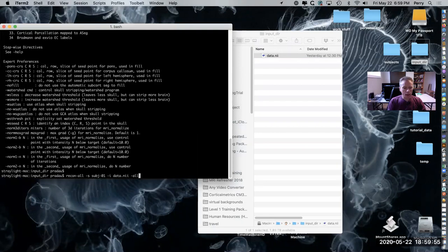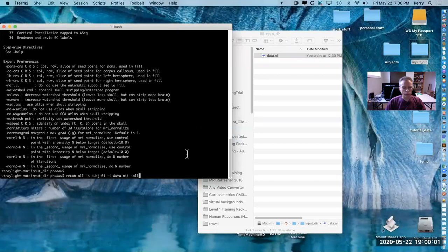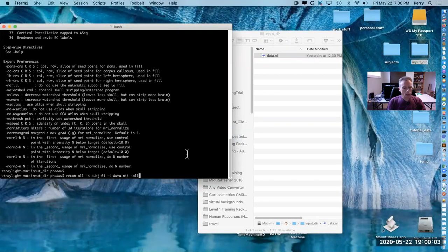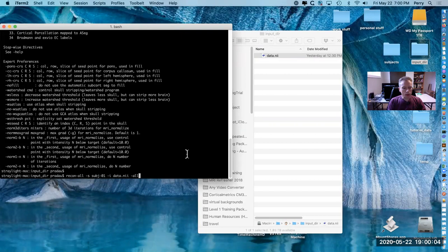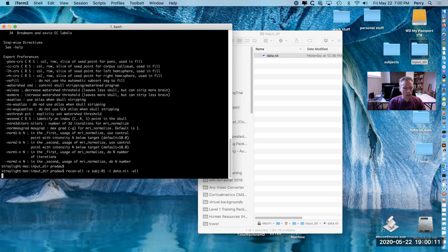The last flag that you need is dash all, and that means go through all the steps that recon-all provides. This is generally what I would use, but if you were doing troubleshooting you might only do a few of the steps rather than all of them. Let's run that.